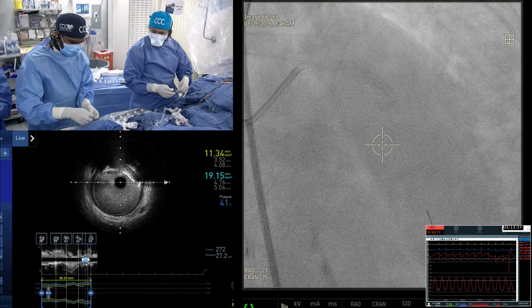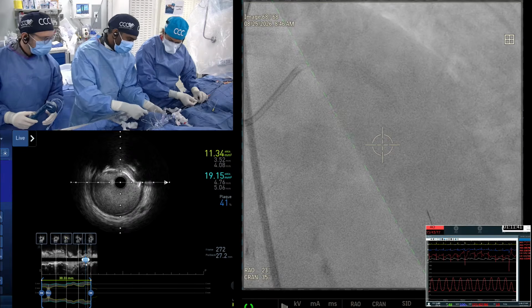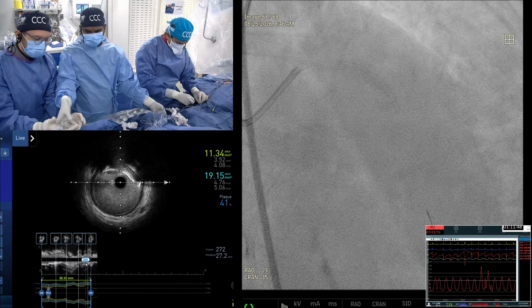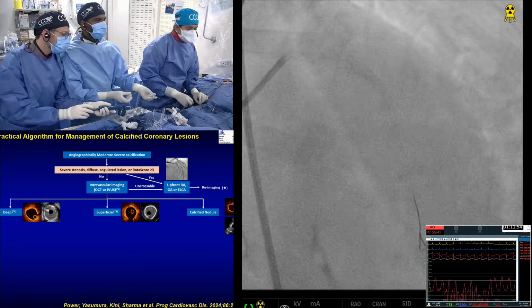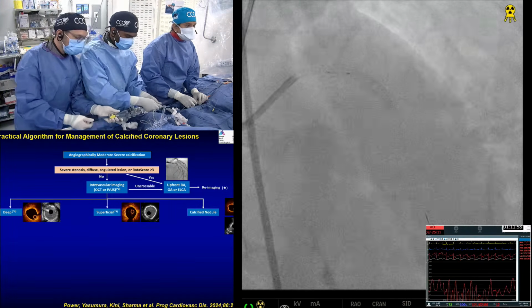Get us a nodule shock slide if SS has it. Yeah, let's slow. 10 more minutes.